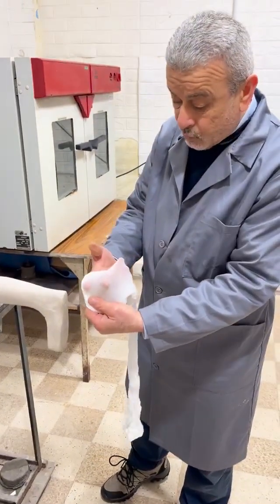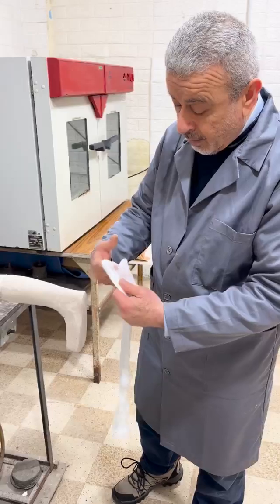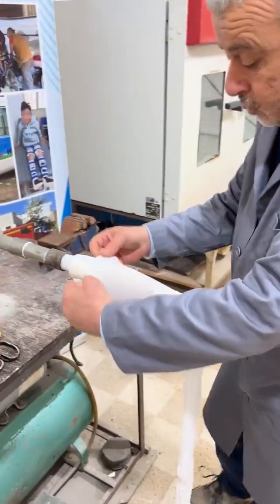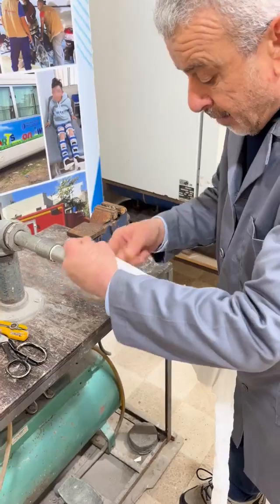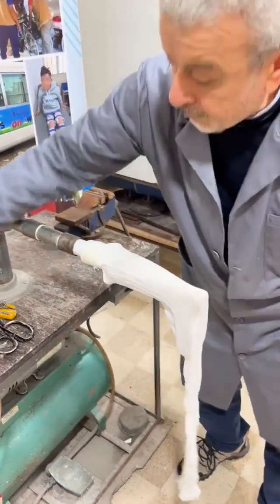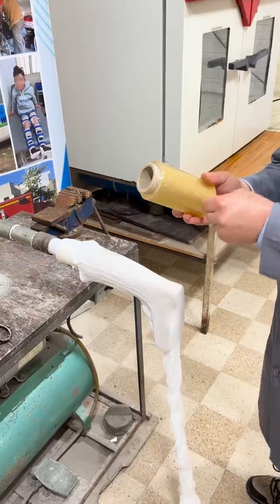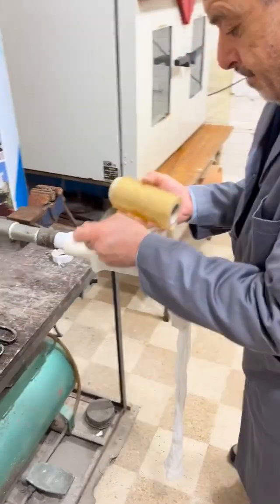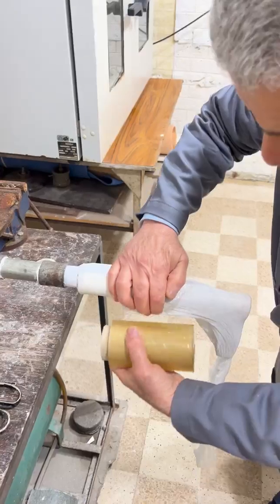After we put that, we pull a very thin nylon — as you see, it's extremely thin — to act as an air wick between the wet plaster and the volara. Then we apply the stretch over it like this.